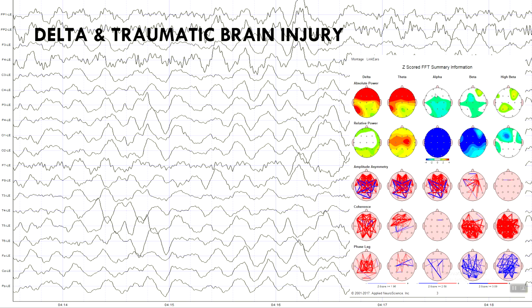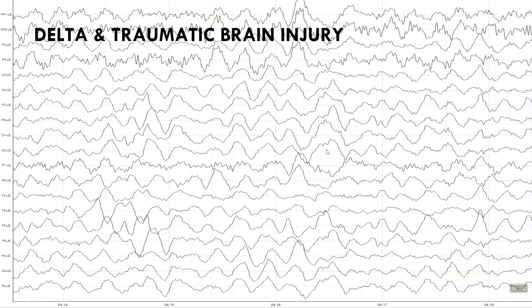It's a point of relativity, essentially. What is normal and where do you fall within that normal range? Not every tree stands straight. And that's one of the things that I tell folks quite often in this field, because my goal and your goal is not to make people normal, but to address the issue. Mm-hmm. And so to align the symptoms with what they're showing in their data, and in this case in their quantitative EEG, is paramount to their recovery or their healing. Okay, so when I talk about high voltage, I'm talking about red. When I'm talking about low voltage, I'm talking about blue.